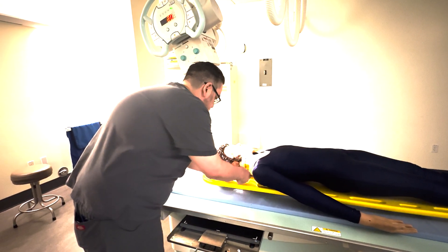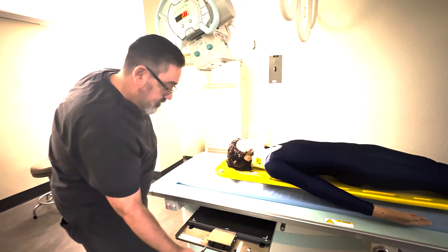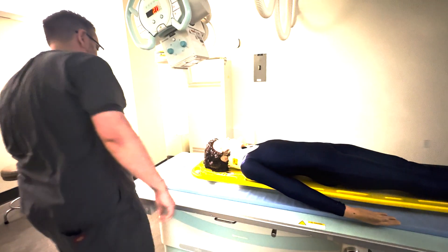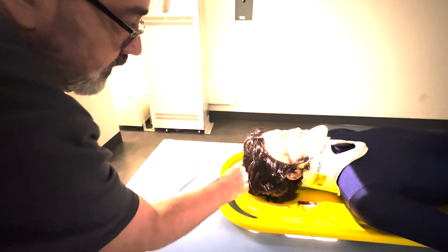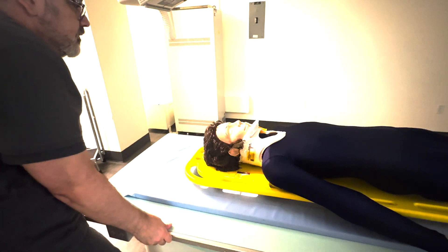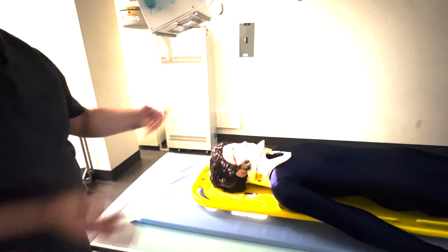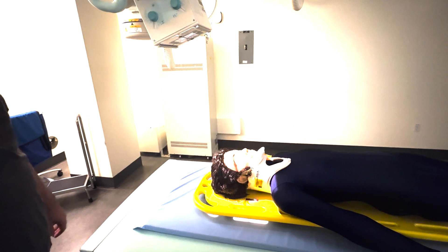I'm going to put my right marker down here and line up my Bucky. I'm going to double-check that I have the top — that looks good. Might clip a little bit, so I'll raise it up just a tiny bit. That looks good. You can always shield your patient, and if they are conscious, you can expose on suspended respiration.